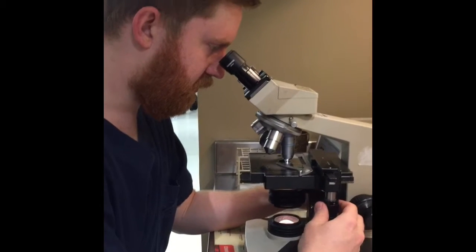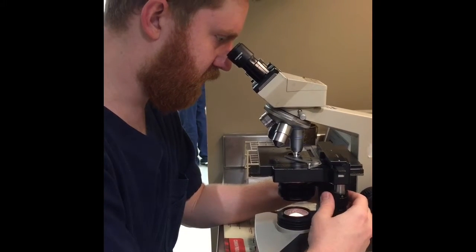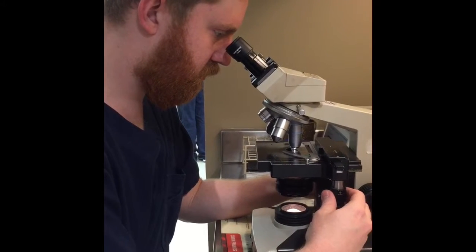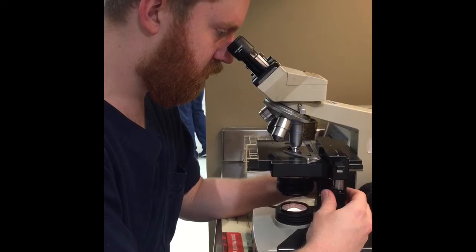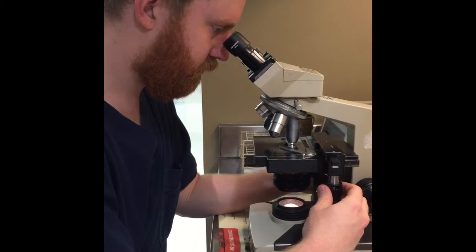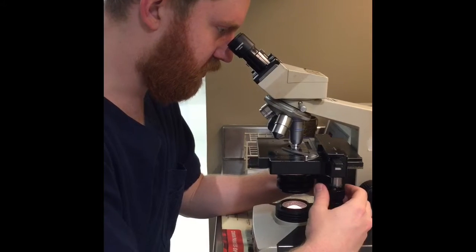I'm not seeing any type of lipid droplets. I'm just seeing a trace amount of red blood cells. But they do seem to be present. I haven't seen any white blood cells.